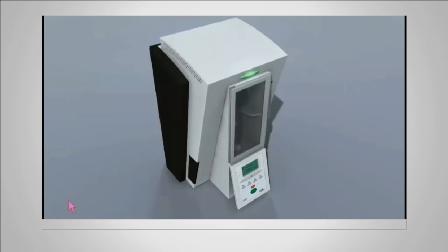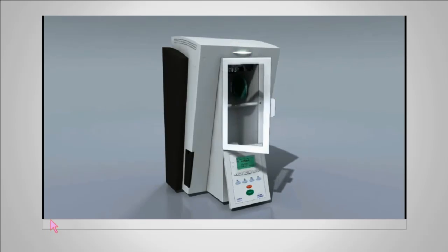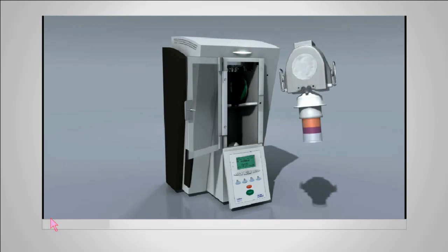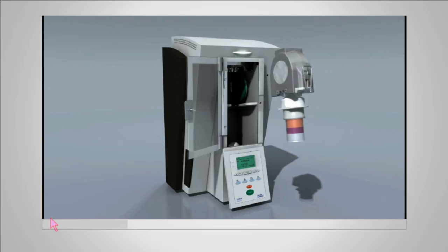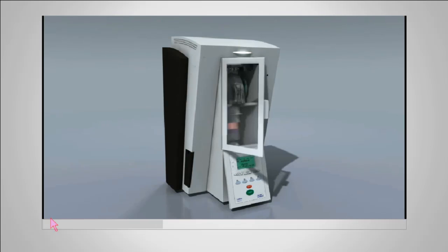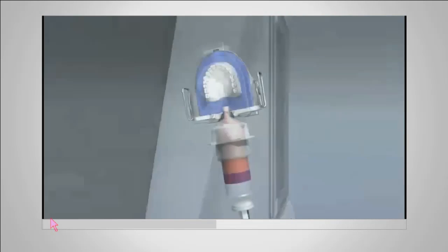There are different kinds of dentures available, and if you are making implant retained dentures, one of the things worth being aware of is something called injection molding. Injection molding is a method by which the denture is flasked. This particular example is made by Ivoclar.